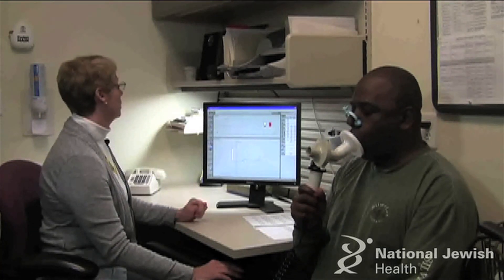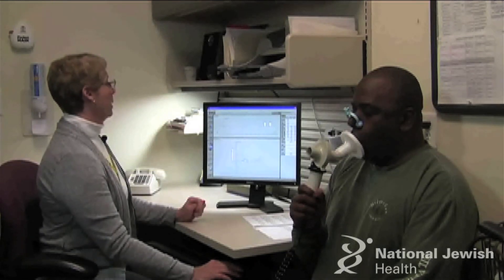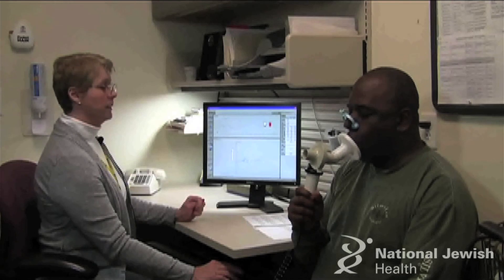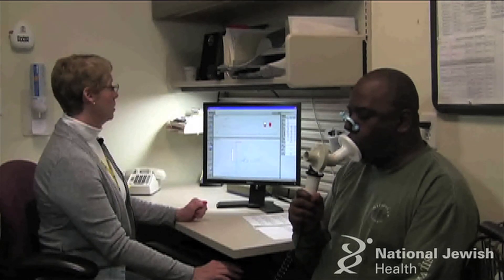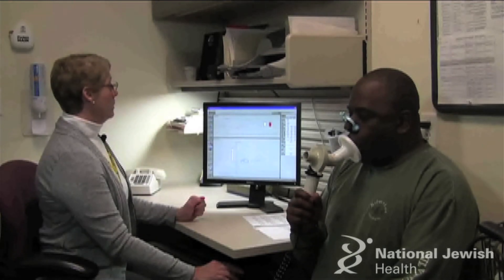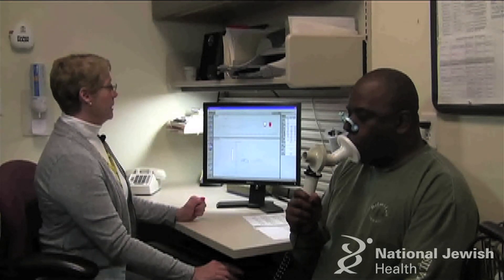Take a normal breath in and empty that one all the way. Empty, empty, empty. Now another normal one in and empty that one all the way. Empty, empty, empty.